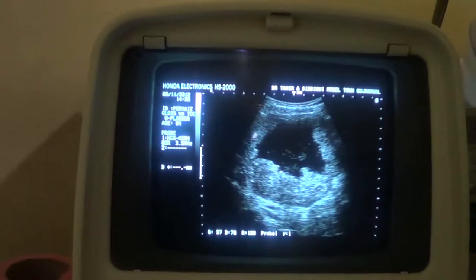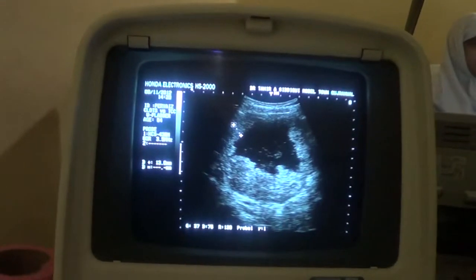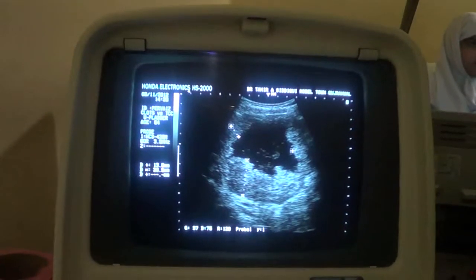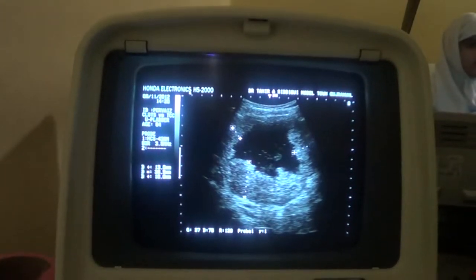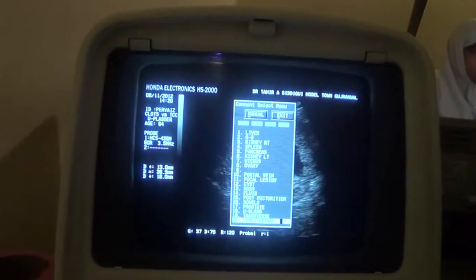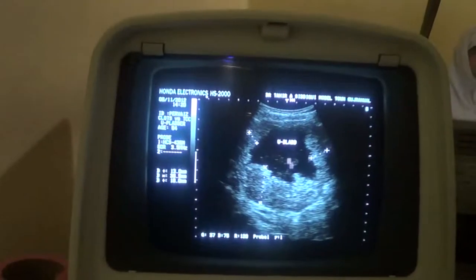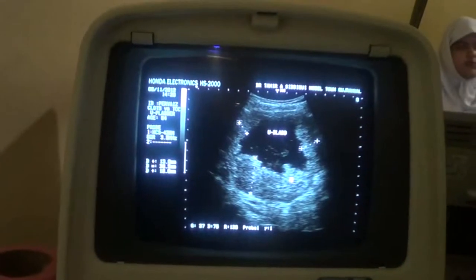This is the right lateral wall, and in this location its thickness is 13 millimeters, and in the posterior wall it measures approximately 36 millimeters. These are approximate measurements, and at the right lateral wall it measures approximately 18 millimeters. So this fixed echogenic band that we are seeing in the urinary bladder in transverse section, along with the echogenicities within the lumen, is suggestive of either clot or transitional cell carcinoma.